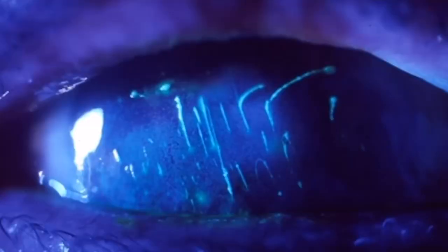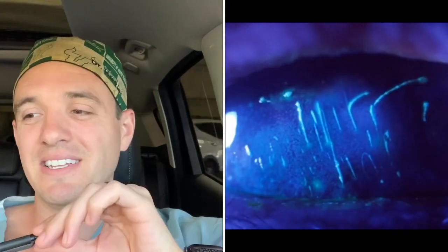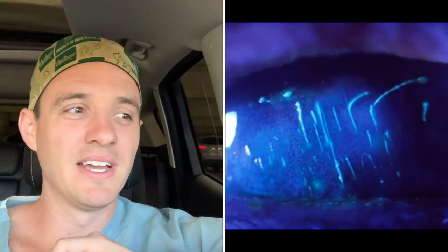What's up YouTube, OptoInfo back with another video. Check it out — what's the diagnosis? If you're an Opto resident you're surely familiar with this: this is an ice rink sign secondary to a foreign body lodged on the backside of the upper lid, and that's what's causing all those vertical or linear excoriations on the cornea. You can see that with fluorescein staining there.